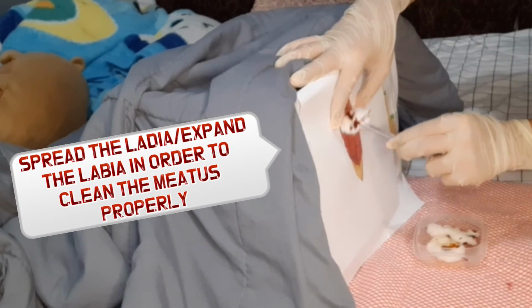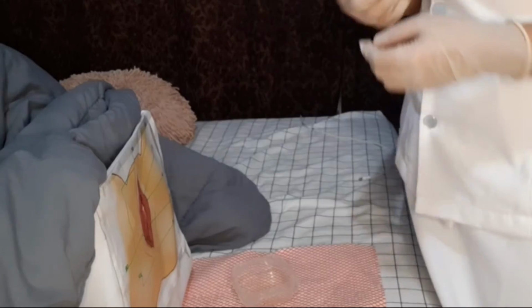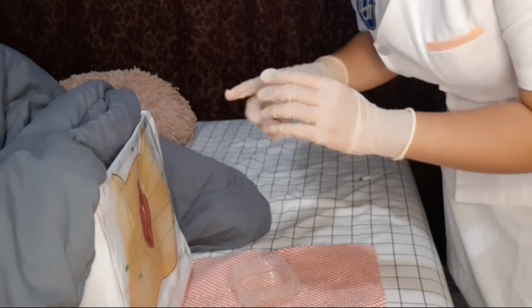So once you use a cotton, you need to discard it after you use it. And then another new cotton, use it and discard it. So what is the rationale of that? It is in order to clean the meatus, as it may contain microorganisms that contaminate the catheter upon insertion. So thus, it introduces the microorganism to the bladder. So using the betadine, it is in order to prevent the microorganism from spreading.